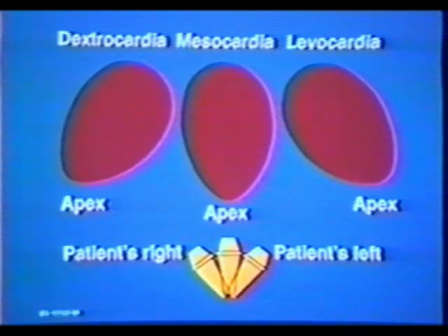The first step in examination is to establish the cardiac position in the chest. Scanning from the subcostal position will readily delineate the cardiac situs. The cardiac apex is usually on the left, referred to as levocardia. When it is on the right side, patient has dextrocardia. And when the apex is in the midline, it is referred to as mesocardia.